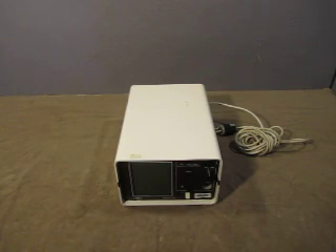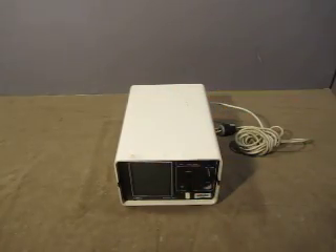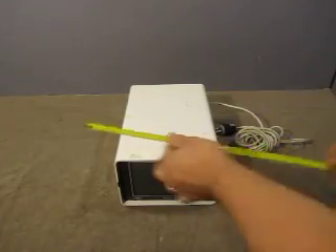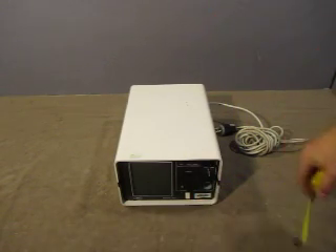Up for auction we have one Bioelectrics Roche Monitor 123-100. The unit measures 14.5 inches by 10 inches by 7 inches.